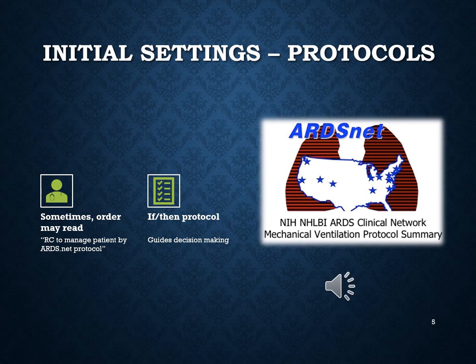Let's say your patient's CO2 level was high, and this is an ARDS patient. All you do is simply follow the protocol. But we know that we would adjust what our tidal volume or rate, or maybe both, depending on how critical the patient is. So what you'll do is simply follow this ARDS.net protocol without having to call your physician and get that order to change settings for your patient. So it does save you that step of having to call to get an order to change a tidal volume or any type of setting.